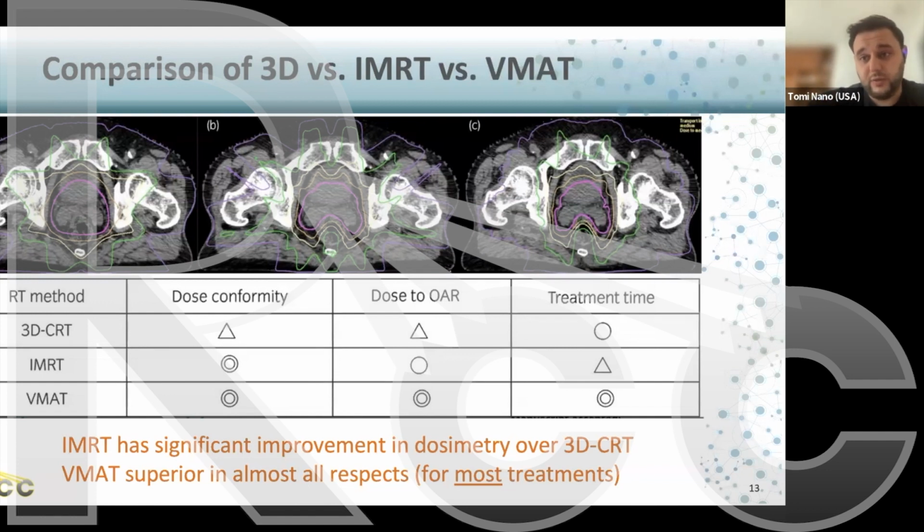And when we do plan QA, we would QA all of the control points in that plan, because that's what we care about. We care about the total dose as opposed to one single control point. But when you're doing commissioning and further testing, usually your static field is essentially a single control point. If you had something more complex that your MLC shapes were conforming to, then that would just be a more complex control point.